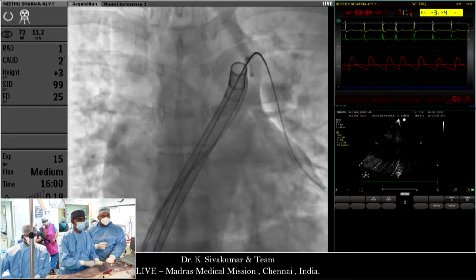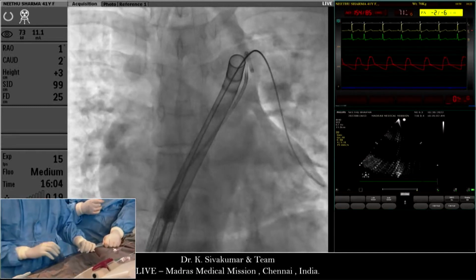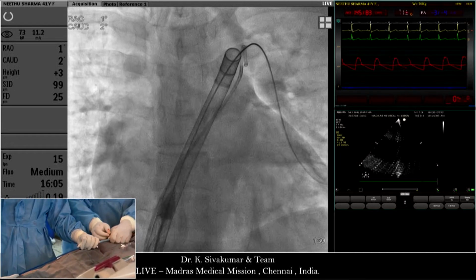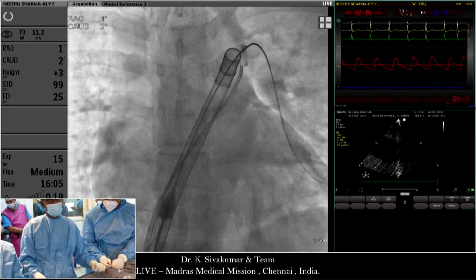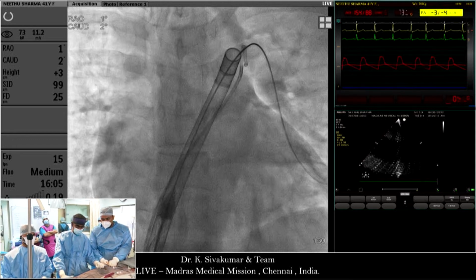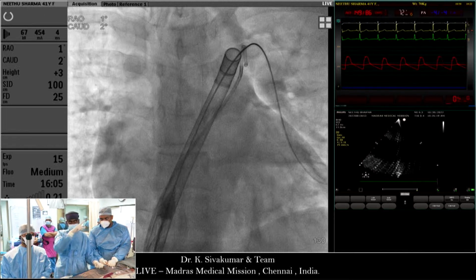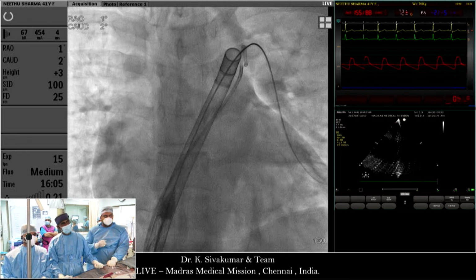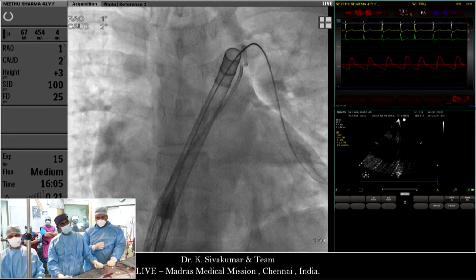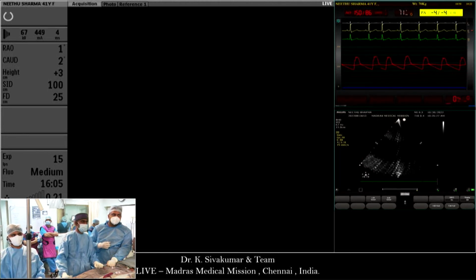36 by 25. I think there's plenty of room distally and proximally. And of course, Varakan, I would go 36 by 30, what you are doing, because most of the time our outflow tract was 30. Well, again, I think 36 should be good for this particular case. And I try to oversize at least 4 millimeter for that waist because it's so expansive distally and proximally, Shiva. And well, LPA deployment should be good also.